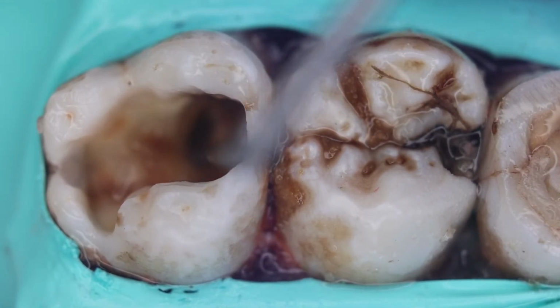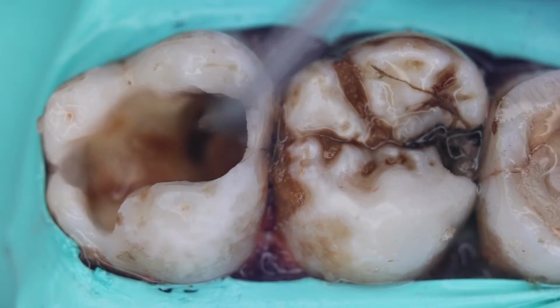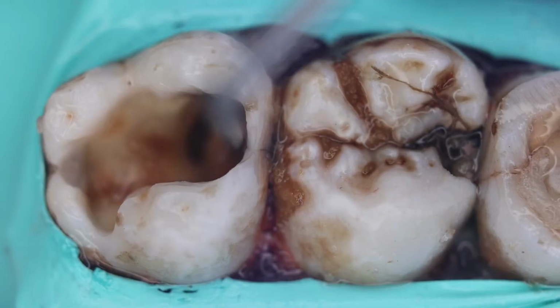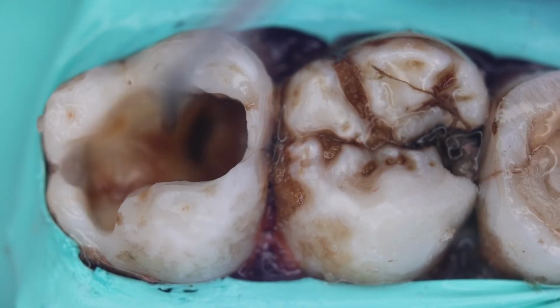If this area is less than 1 millimeter, you got the idea how we remove.